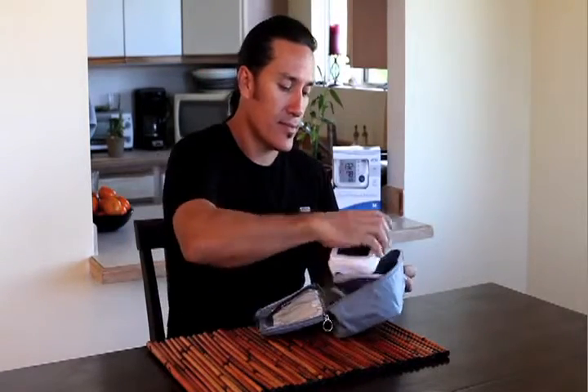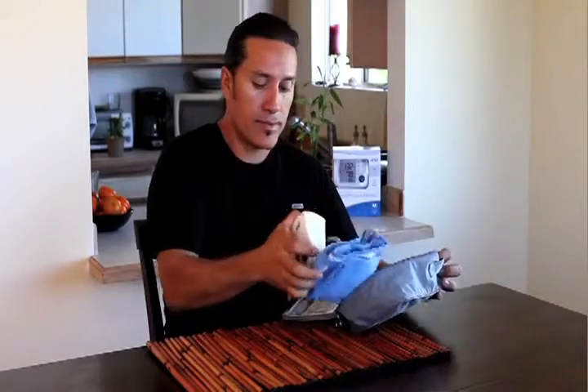When you use the blood pressure monitor for the first time, or after replacing the batteries, your first step is to set the date and time.